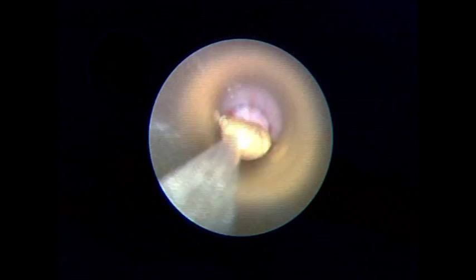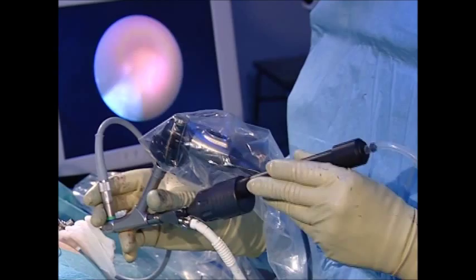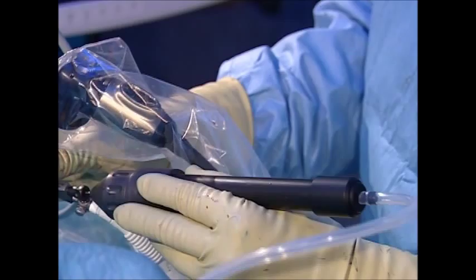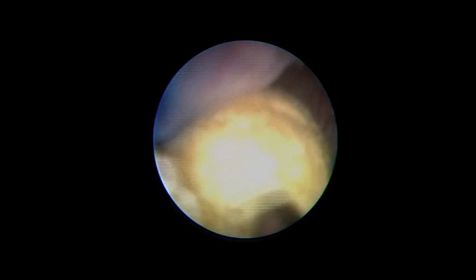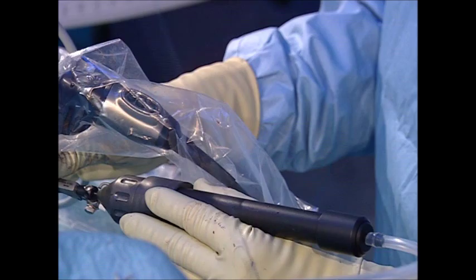The stone is trapped between the lithotripsy probe and the urothelium and then fragmented with the lithotriptor. During ballistic lithotripsy, it is important not to increase the pressure on the stone any further in order to prevent urothelial lesions. Direct pounding of the urothelium leads to contact bleeding. Lithotripsy should therefore only be carried out when the tip of the probe is directly visible. Fragmenting to a grain size of three to four millimeters has proved ideal for the fastest possible extraction even of larger calculi.